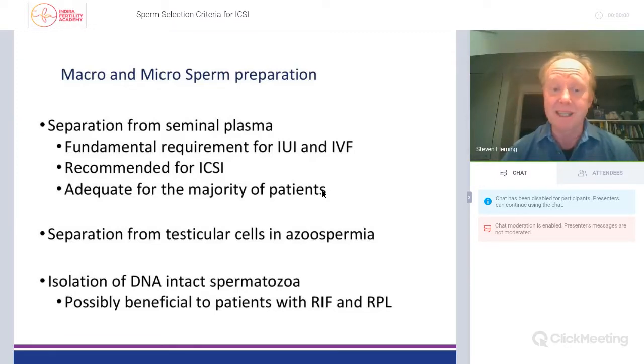And indeed, it's recommended for ICSI, and I will show you the data that shows why that's the case. Although in some situations in the past, when there's been only maybe one ICSI rig, I know that, for example, you can drop a drop of seminal plasma plus sperm into a large drop of medium overlaid with oil and just wait for the sperm to swim out. So that's a very quick way of sperm preparation for ICSI. And indeed, separation of sperm from the seminal plasma is probably quite adequate for the majority of patients where there are not underlying problems with DNA fragmentation, for example.